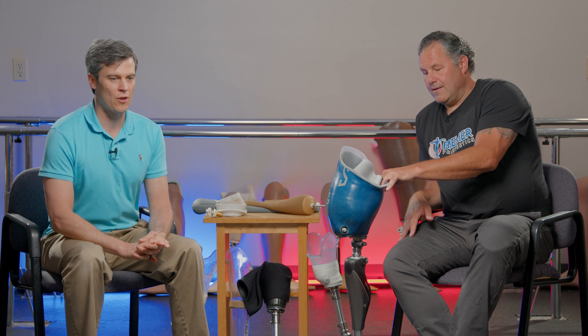A transfemoral prosthesis is another name for an above-the-knee prosthesis. Historically, above-the-knee prostheses have been held on by suction, with the socket being right up next to your skin, belts, suspenders, and people really did rudimentary things to keep above-the-knee prostheses in place for years and years.